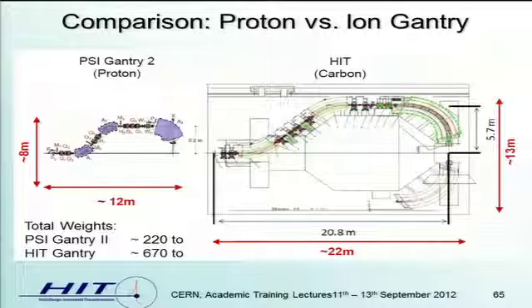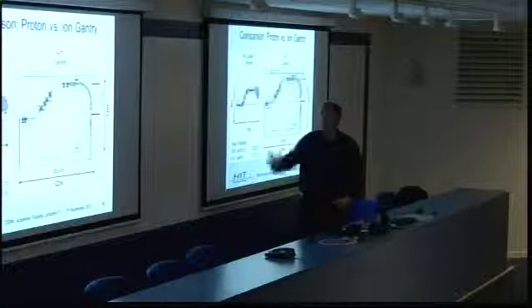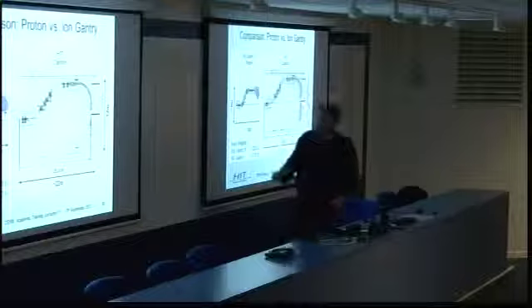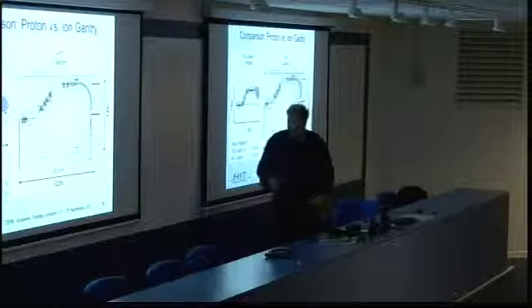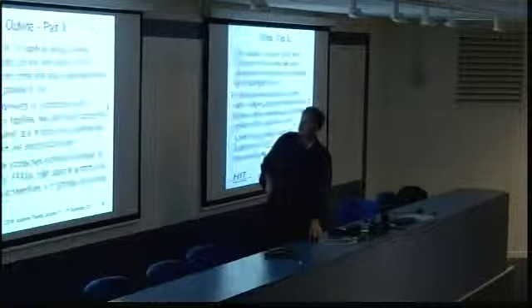So this is clearly not the end of the development, and I will show you tomorrow what is going on there. Especially clearly we have all normal conducting magnets, and I think we will switch, or one will switch in future to superconducting ones. But this is a delicate story. I will come to that tomorrow. But nevertheless, it's the first worldwide ion gantry, and it will irradiate patients starting now in October. And well, we will see what are the outcomes for the patients and for the tumor treatments.